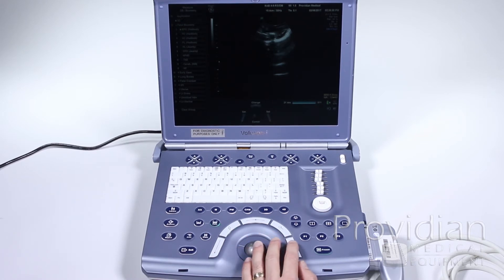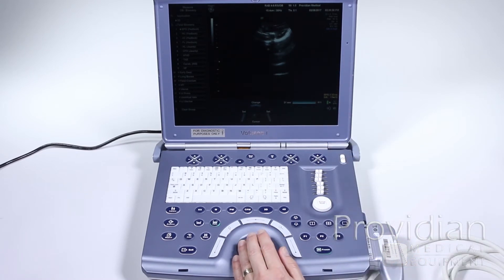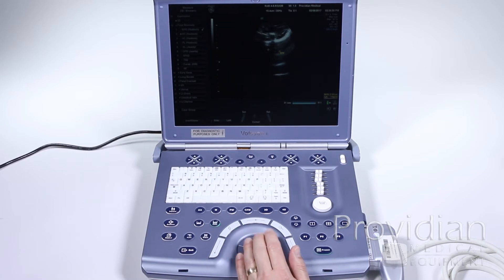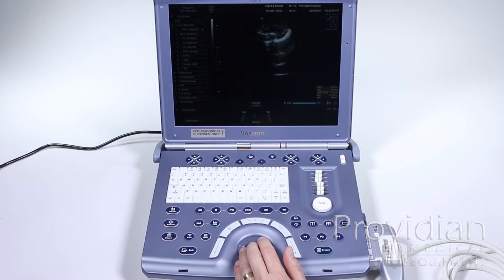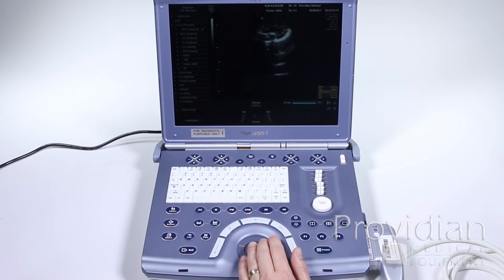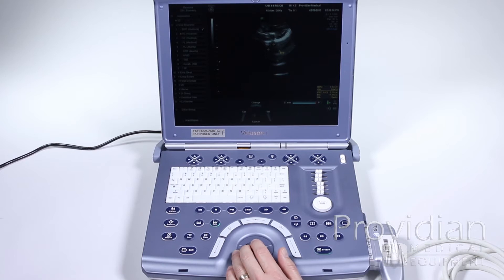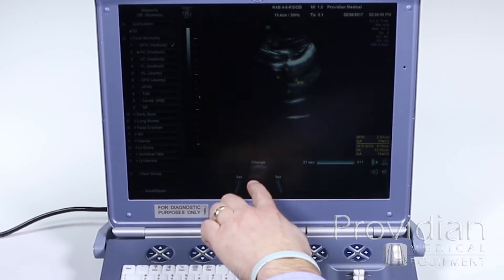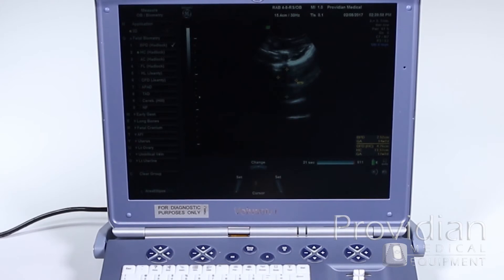I can take my first measurement and here it's going to give me a biparietal diameter and gestational age. Click and save that. Head circumference — hit set and now I've got that ellipse. First I'm going to hit this and then hit set, then I can change the ellipse. If I want to change either of those cursors, I press that top key to go back and forth and change each cursor.